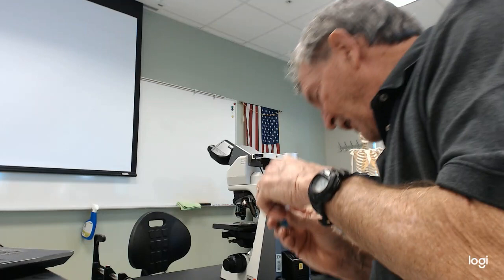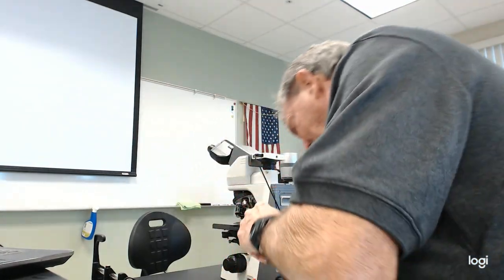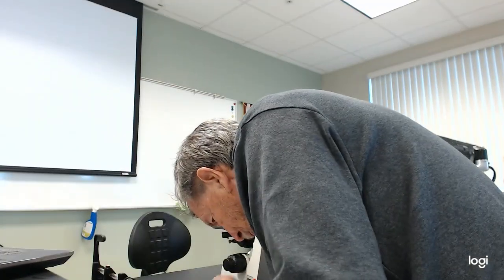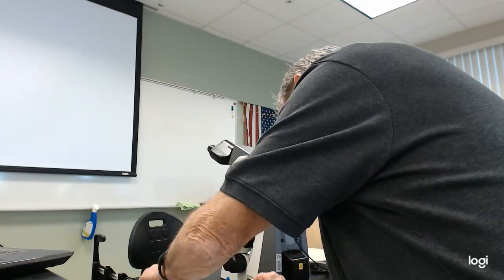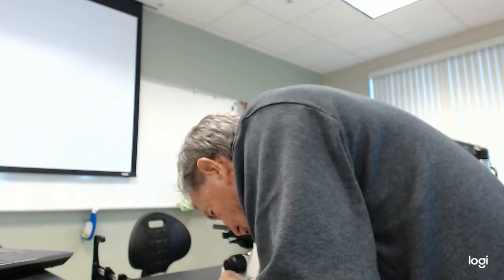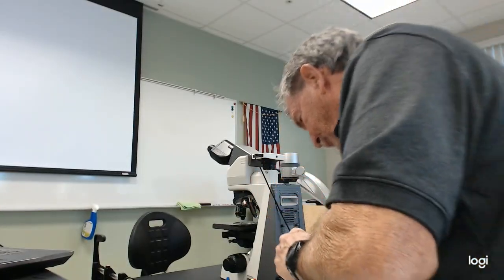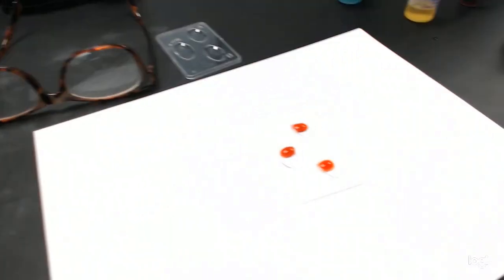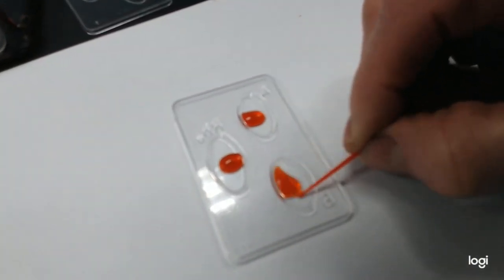A goes in the A. B goes in the B. And RH goes in the RH. So here we have our three samples.